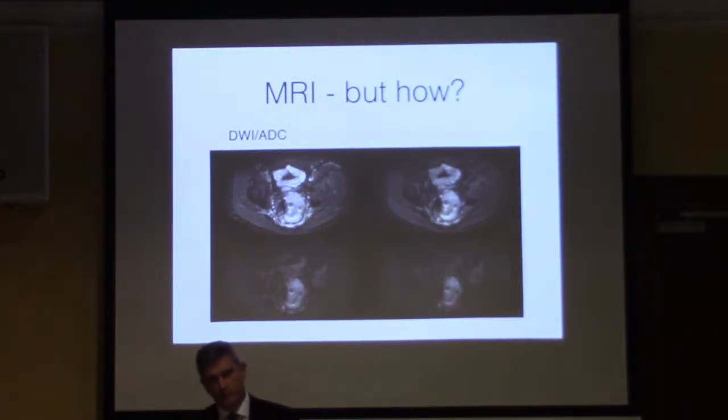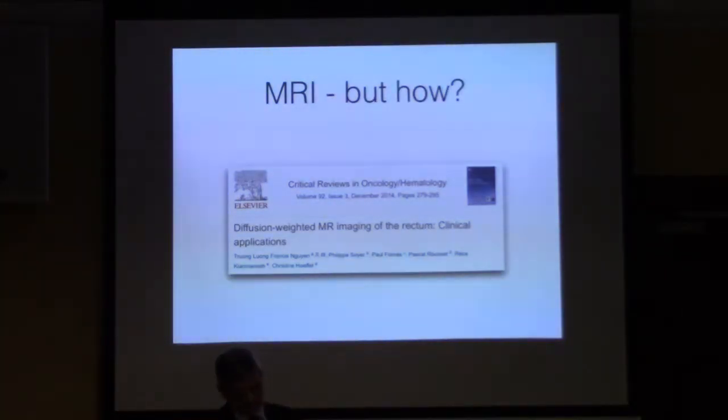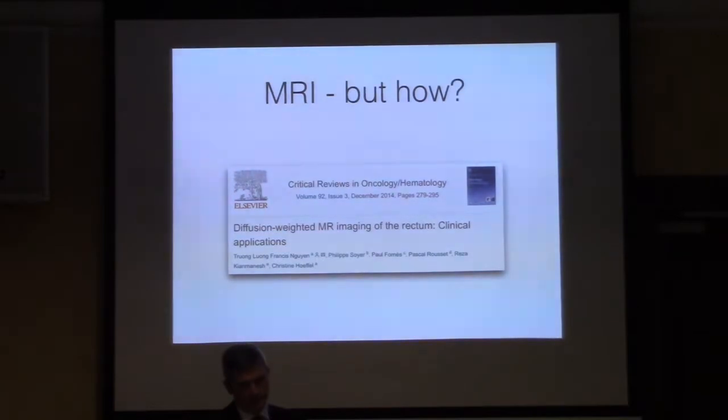And I'll tell you when we come to slightly later what I think DWI is for. I know that we use it extensively in other areas, particularly liver imaging, inflammatory conditions. It's very useful for identifying areas of abnormality. And there's been an extensive amount written about what DWI is for, and the hope is it's so fantastic it's going to tell us about where the rectal cancer is and all about the nodes.